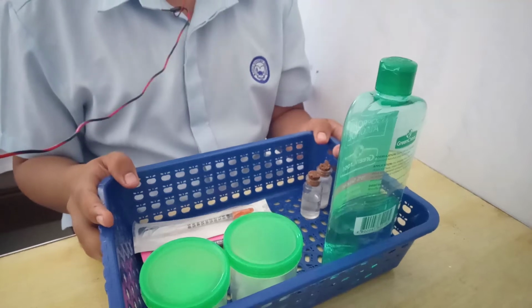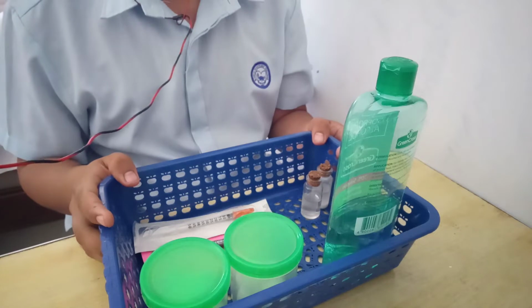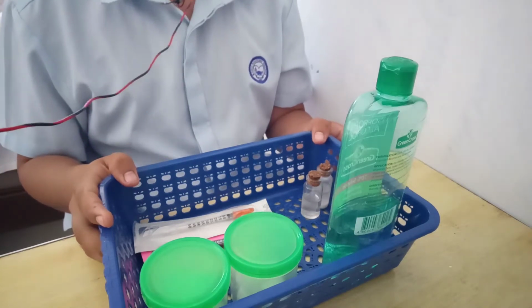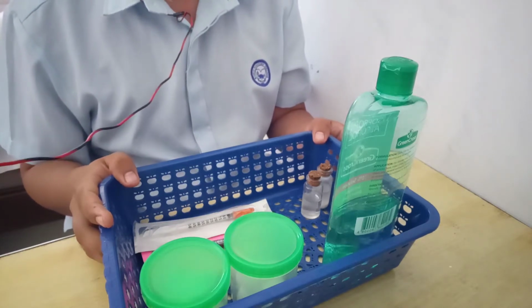So today I'm going to demonstrate how to mix both long-acting insulin and short-acting insulin in one syringe. So the first thing that we must do is check the medication order in the patient chart.